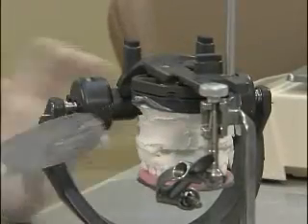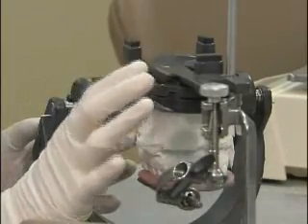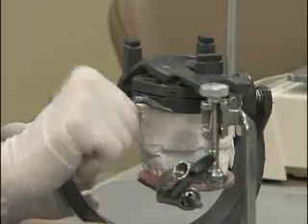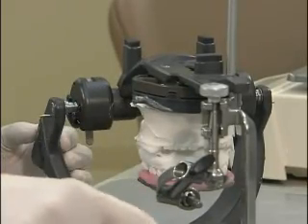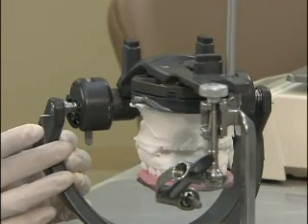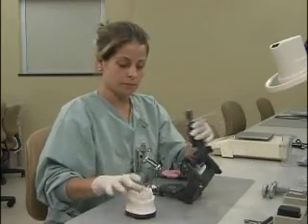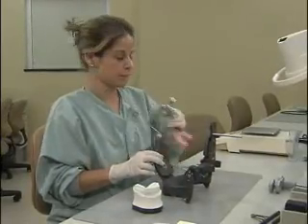Now open the articulator and remove the articulator post. Give the model time to set thoroughly before removing it. Now that the stone is set, remove the model from the articulator. Take your transfer jig and bite fork off also.